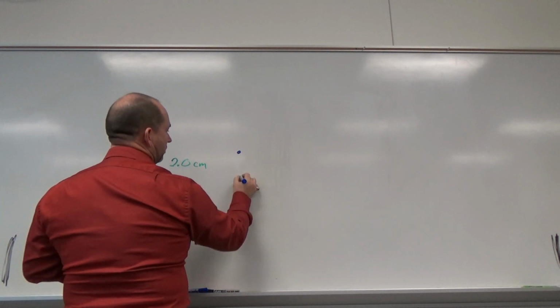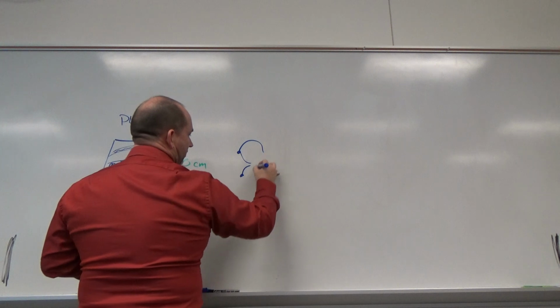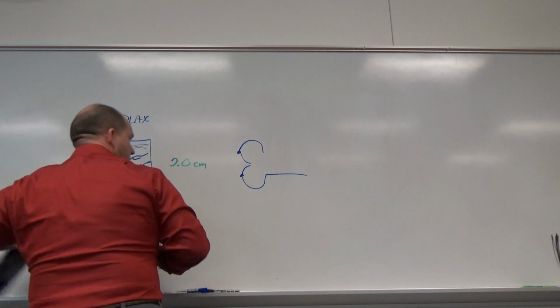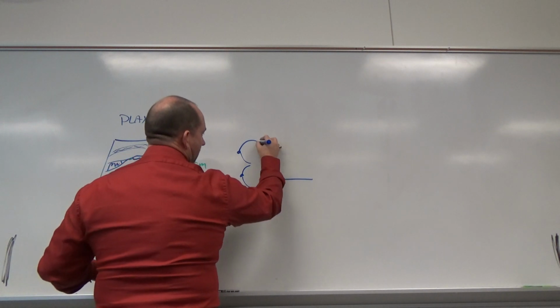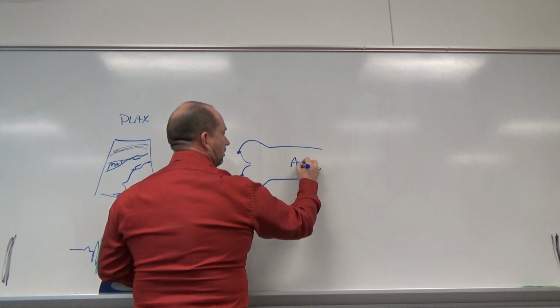So we've got our annulus, which is kind of the beginning of it. This is where the valve would come. We have the sinuses of Valsalva. I'm going to over-accentuate those. They come down. Now let me make it not so big there. Goes down, and then it kind of comes out and becomes tubular at that point. So this is the tubular aorta, ascending aorta.